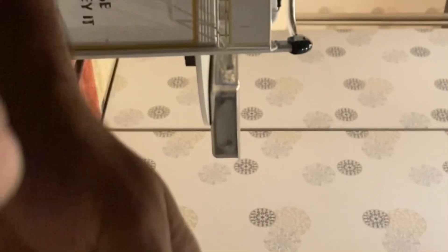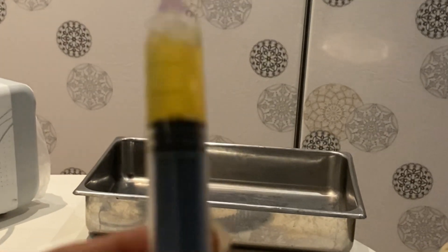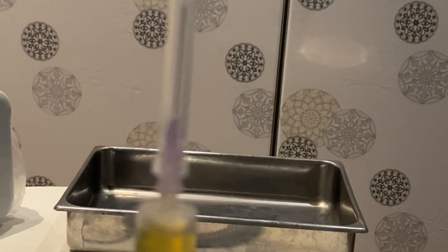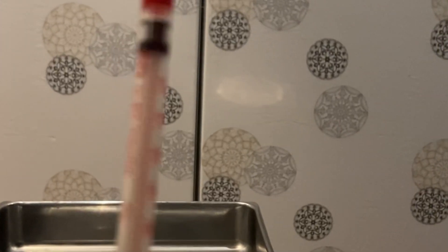You can see the plasma. This is the plasma — I've taken it out from the tube. Now we have to take it in small insulin syringes and then apply.